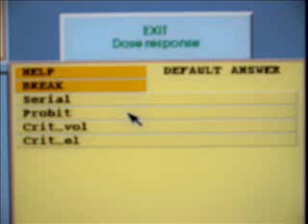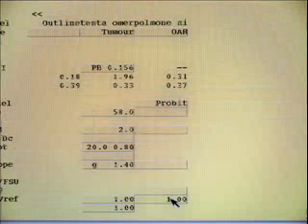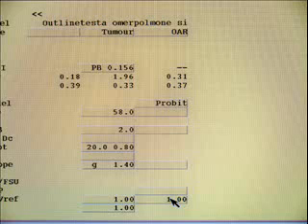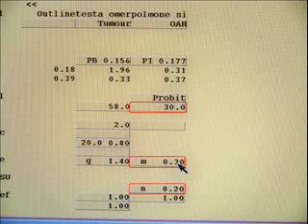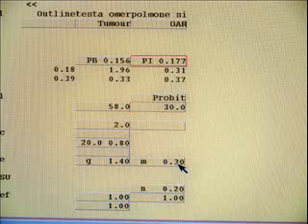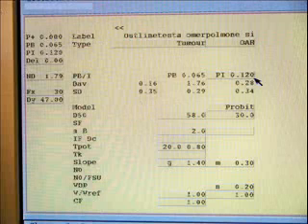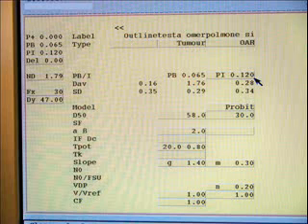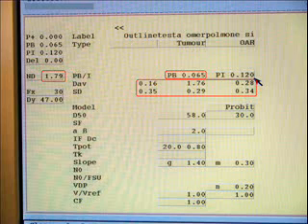For risk organs, four different NTCP models are available: the seriality model, the probit or Lyman-Kutcher-Burman model, the critical element model, and the critical volume model. As for the TCP calculation, we can specify the D50 level of complication and the dose response slope. For the Lyman-Kutcher-Burman model, the slope parameter is denoted M. The NTCP models generally contain a volume dependency parameter; in the Lyman-Kutcher-Burman model it is denoted N. When a sufficient set of NTCP parameters has been entered, the NTCP value for this risk organ is automatically calculated. If the NTCP is higher than acceptable, it is possible to directly enter an acceptable NTCP value to see how the entire dose level will be affected by this NTCP reduction.